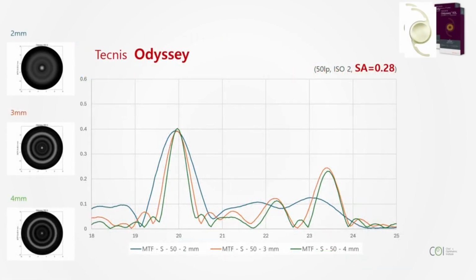And briefly, I bring one slide with all these lenses. We just tested lenses. This is quite an interesting lens I have ever tested, because as we can see here, there is no change in the distant peak. So it is providing consistent distant vision and also the intermediate and the near part. It started from 1 diopter, reaching out to the 3.5 near function. So we can expect consistent distant, intermediate and near function.